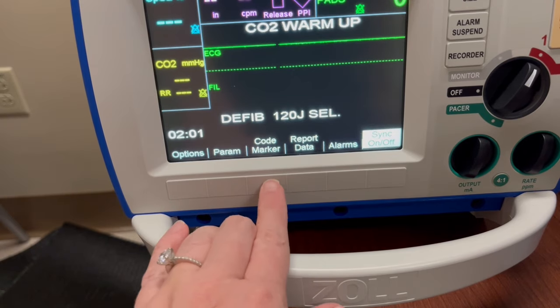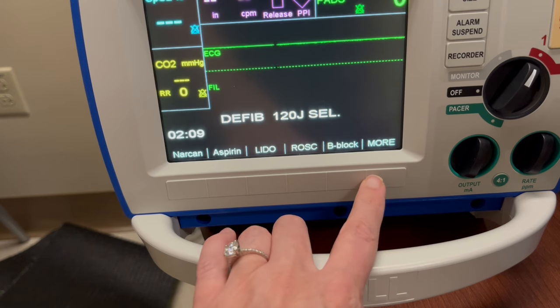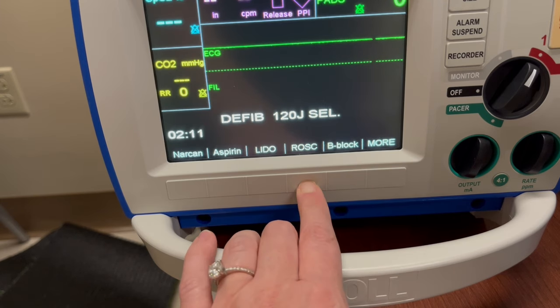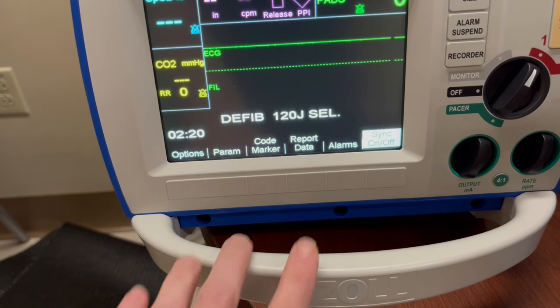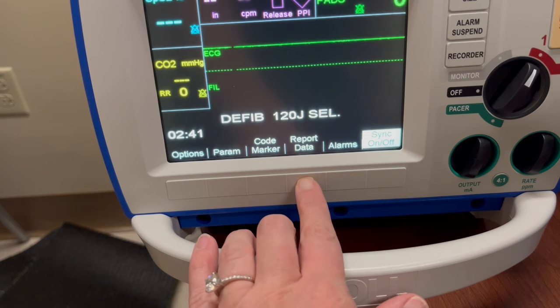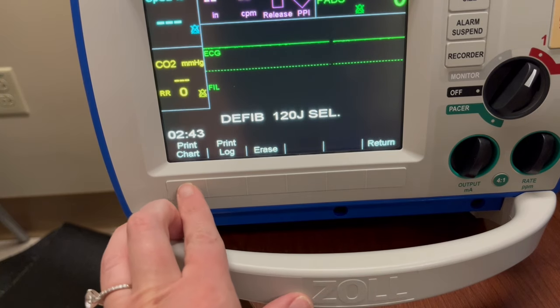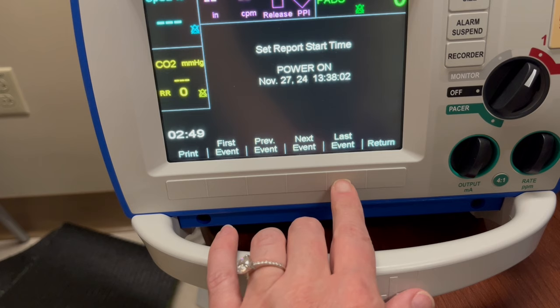Next you will see the code marker key, where you can record things that happened during the code — for example, what medications were given or if the patient was intubated. At the end of the code you can print out the information and use it to help fill out your code form. To print, select Report Data and then Print Chart, then go to Print Range and select which event you would like to print.